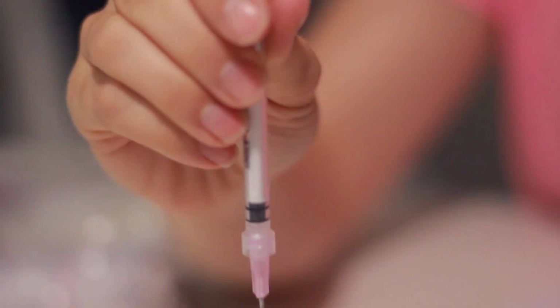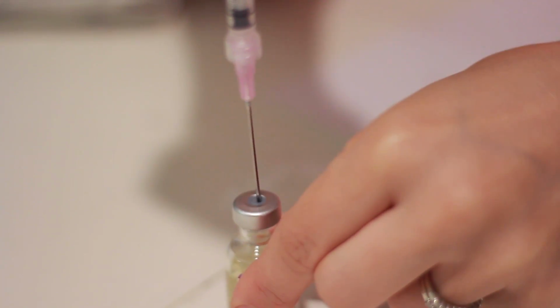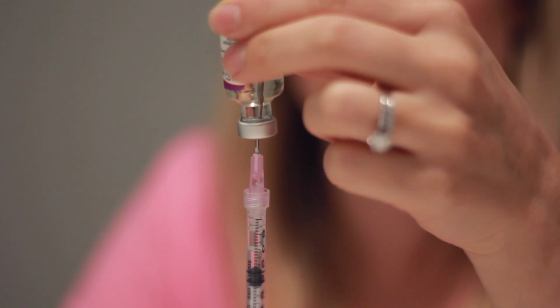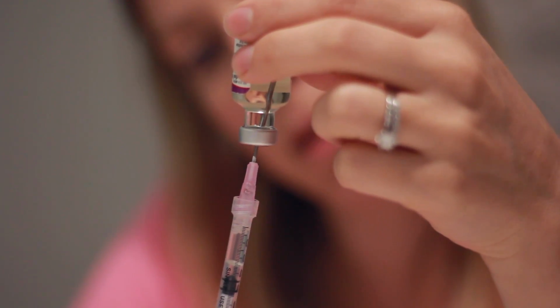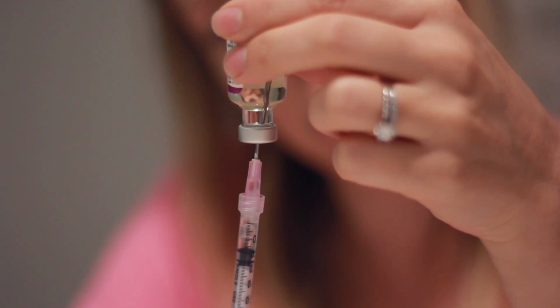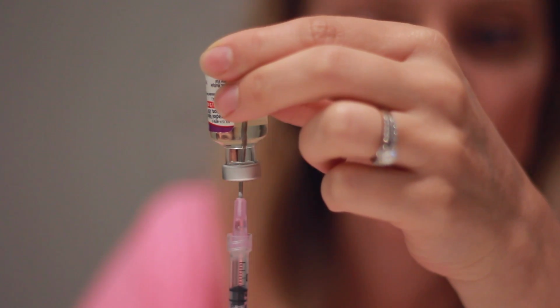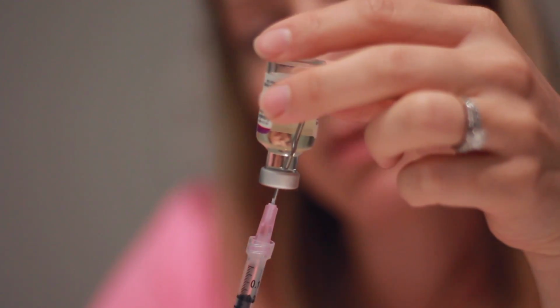So I am going to pop off the top. I am going to set this top down because I'm going to reuse that. And I'm gonna go straight down into my vial. It's a thick needle. Flip it over. Make sure your needle's in the actual medication part and pull back the point two. It looks like there's some bubbles coming with it, so I'm gonna push those back up, shake it around and try to pull back. And I'm gonna pull back to my dose without having any bubbles in there.